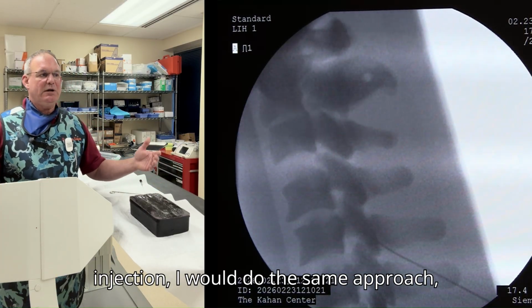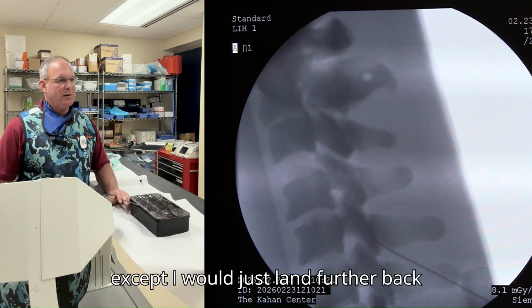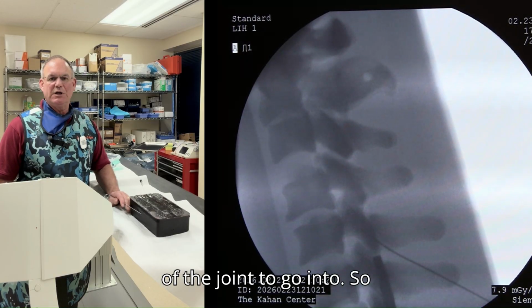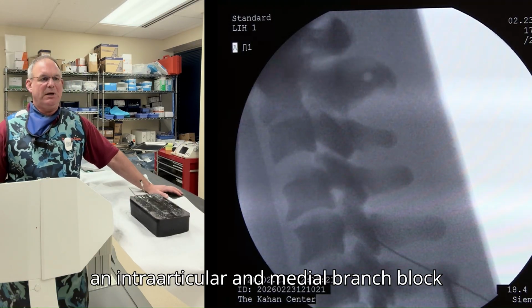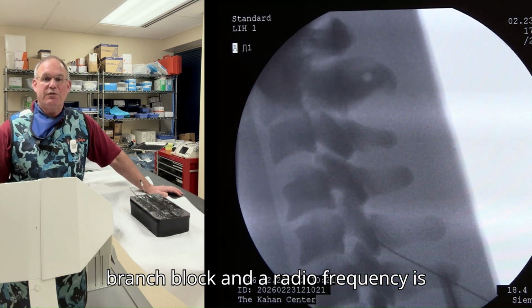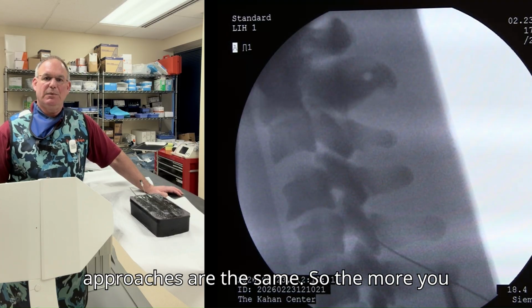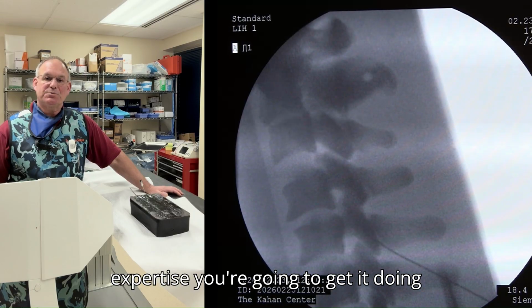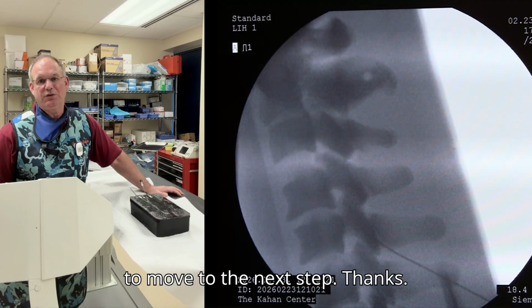If I wanted to do an interarticular injection, I would do the same approach, except I would just land further back here. I'd be aiming for that part of the joint to go into. So that's really the only difference between an interarticular and a medial branch block. And the only difference between a medial branch block and a radio frequency is you're using an RF cannula. The approaches are the same. So the more you repeat the same procedure, the more expertise you're going to get at doing it, and it'll make it easier for you to move to the next step.